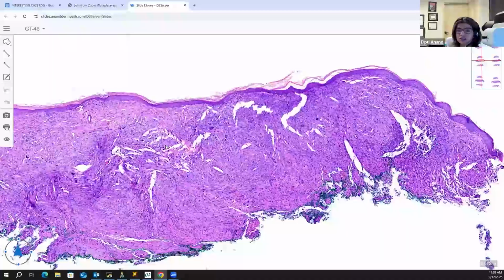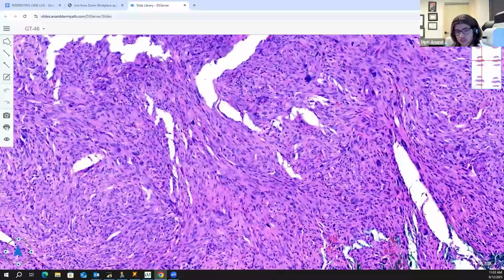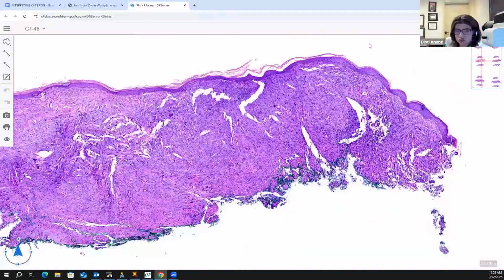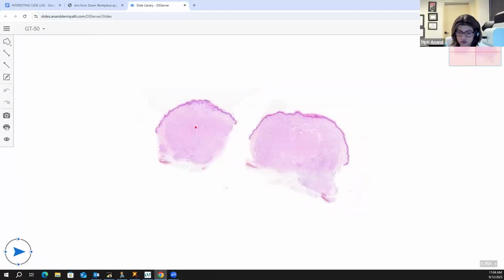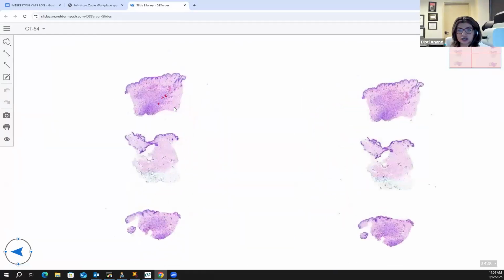So even though this tumor is fibrohistiocytic in derivation, it's a malignant spindle cell neoplasm, which is a diagnosis of exclusion. And we'll talk about AFXs when we talk about non-melanoma skin cancers. But remember that this can occasionally mimic a granulomatous tumor. The location, the sun damage, is very classic for this tumor. The next common mimicker is this particular entity, and that would be the granular cell tumor.